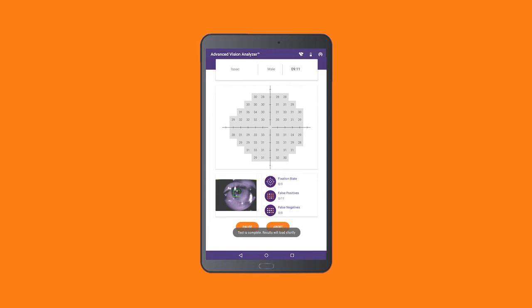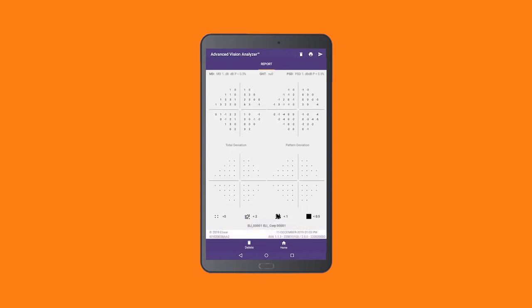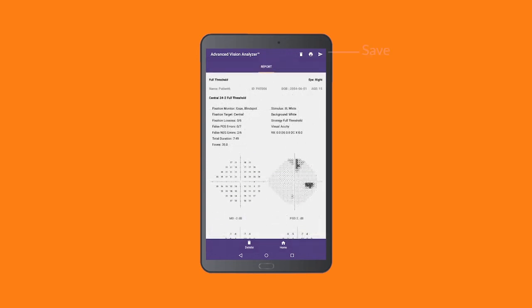Once the test is over, the results will automatically be displayed on the test controller. At this point, you have the option of saving the patient data locally, printing, or sharing the patient reports via Gmail, Messenger, SMS, or Bluetooth via the menu icons in the top right of the screen.